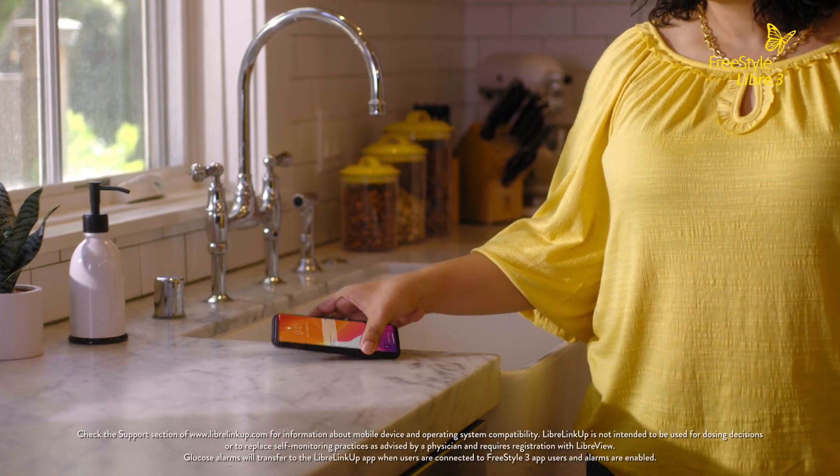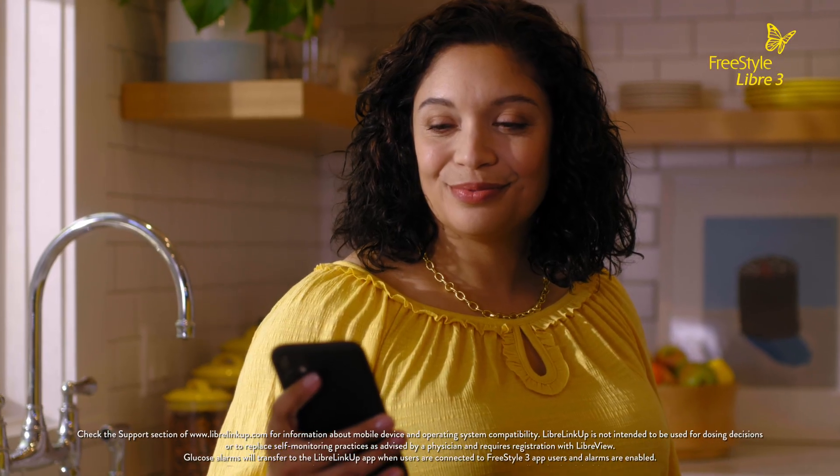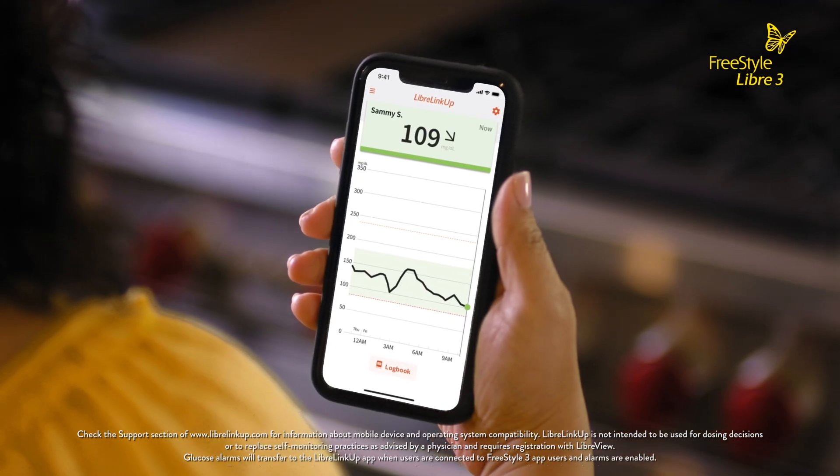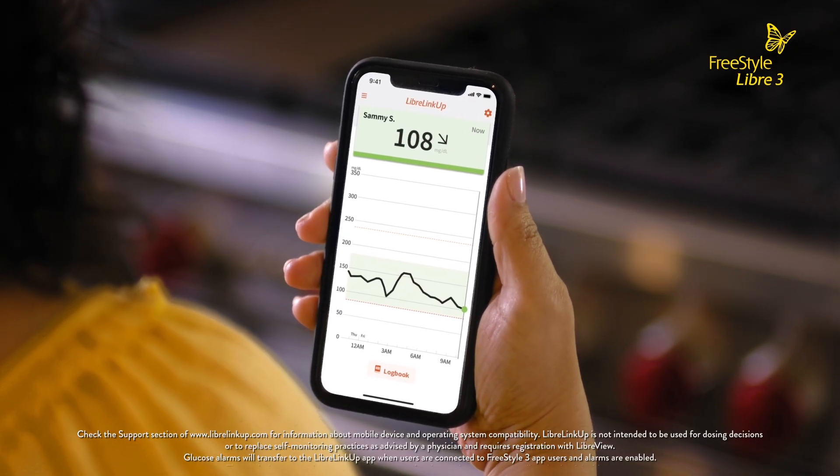I like using the LibreLinkUp app so I can be in the know too. Whether she's at school, playing sports, or sleeping, I can monitor her glucose wherever I am because her glucose readings are sent directly to my smartphone every single minute.